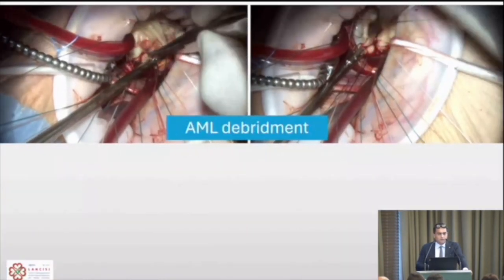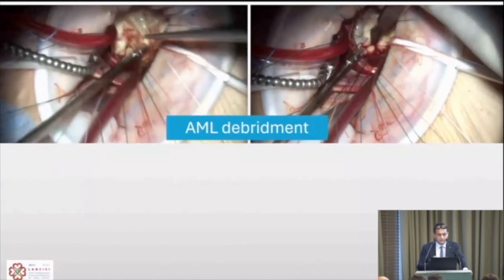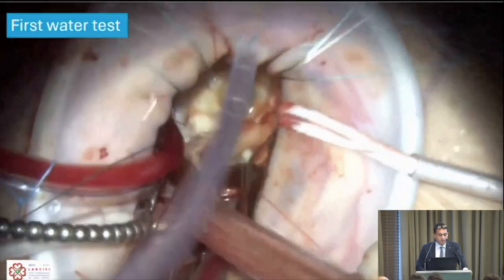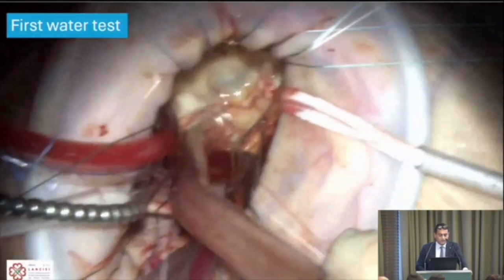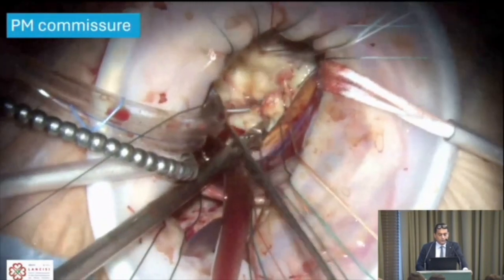We begin debridement of the valve, cleaning with forceps, knife, and scissors at the level of both the anterior and posterior mitral leaflets. Taking a second look, the valve is getting better and better, though we know there is a problem at the level of the posteromedial commissure.